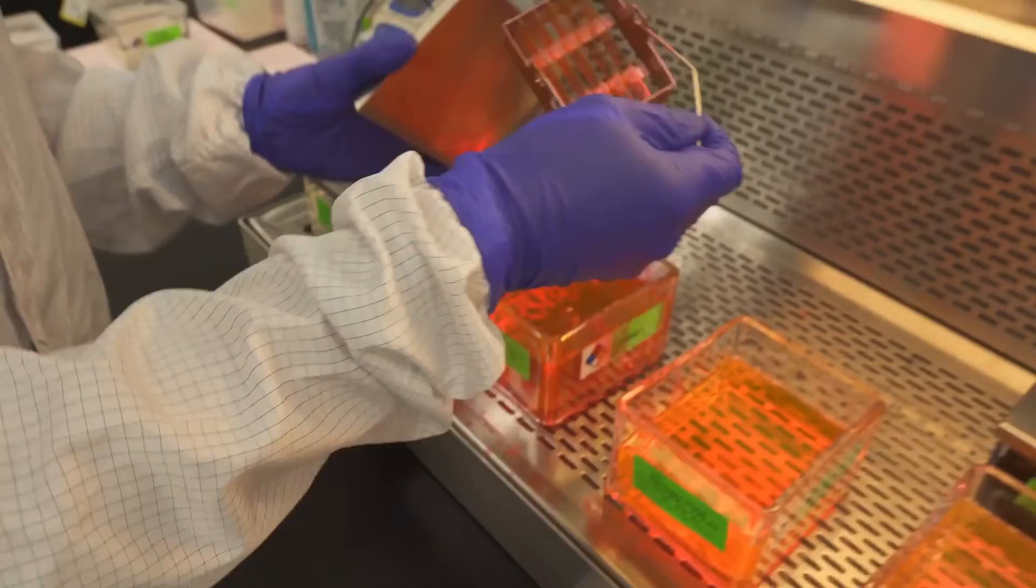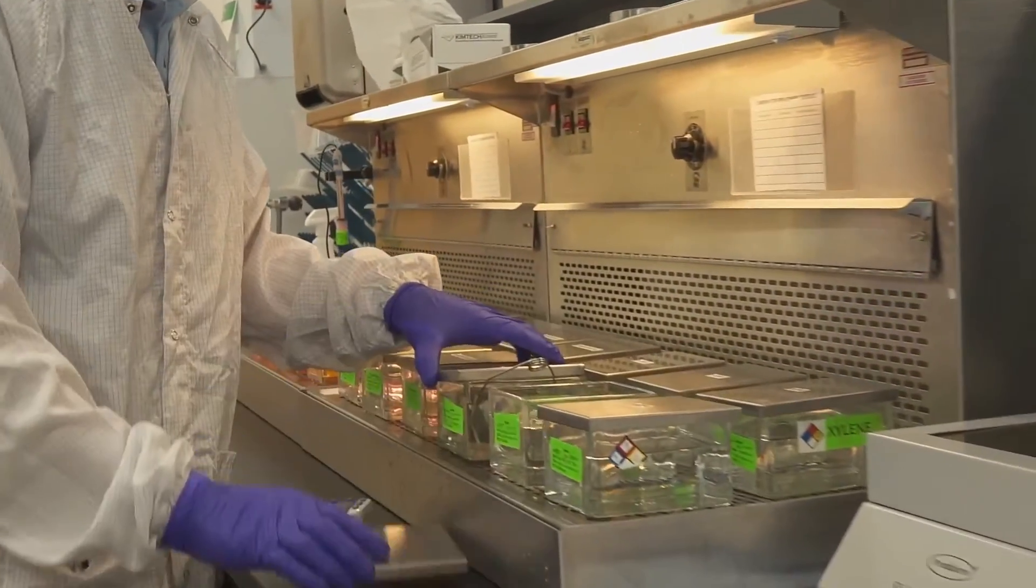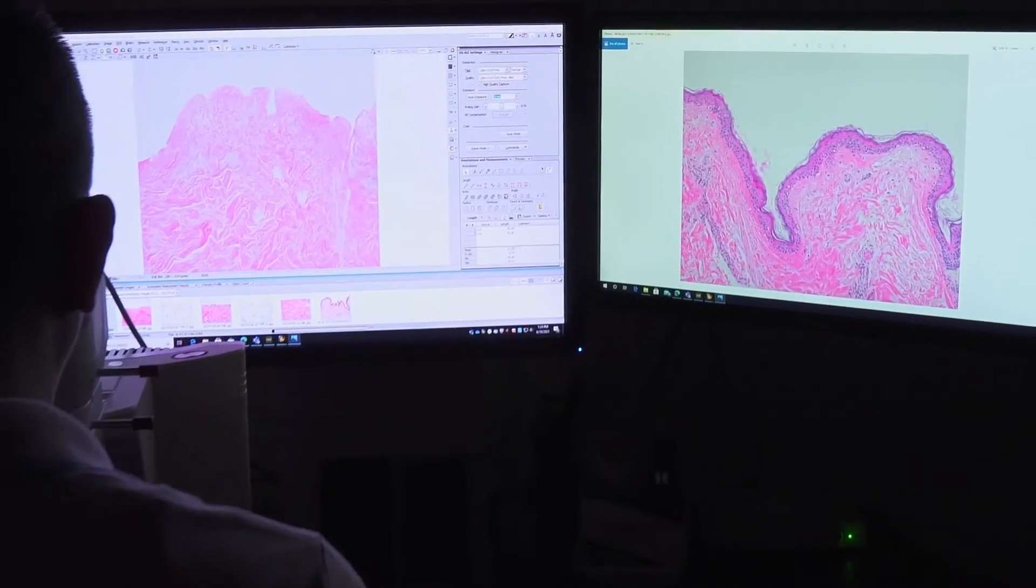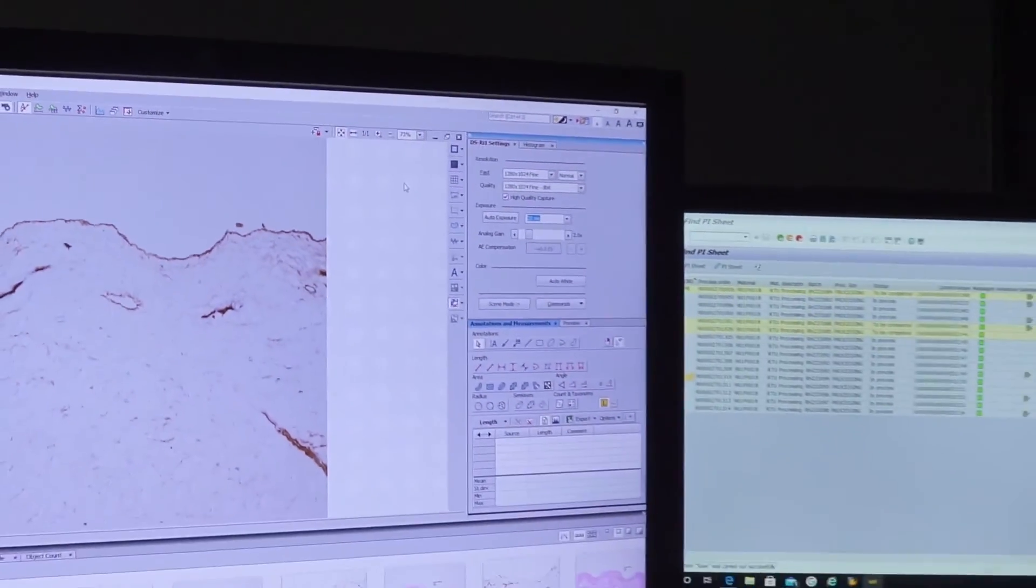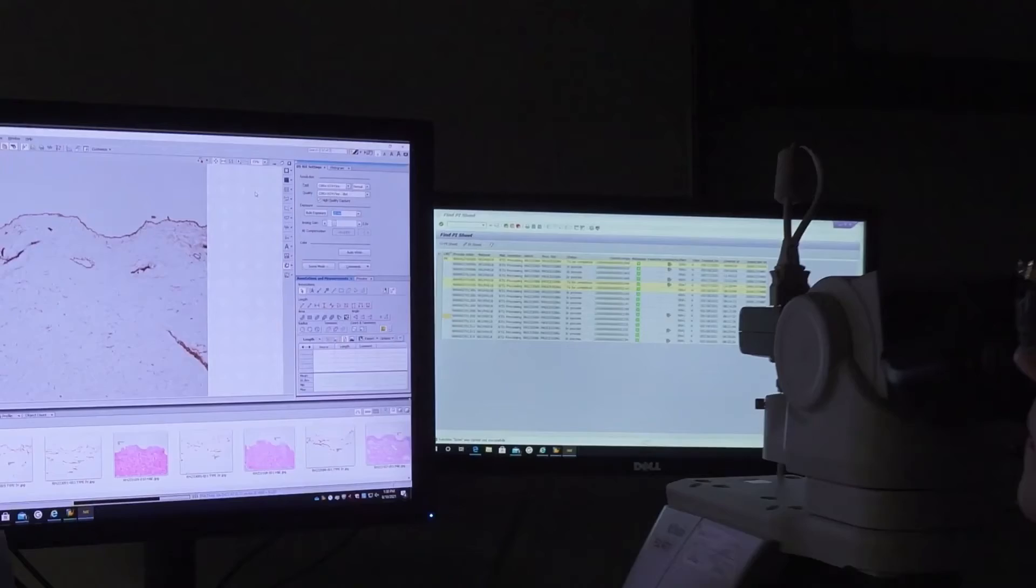We use H&E and immunohistochemistry staining to ensure successful removal of epidermis, intact basement membrane, successful removal of cells, and preserved structural integrity, among other things. No tissue leaves the plant if it does not pass these criteria.